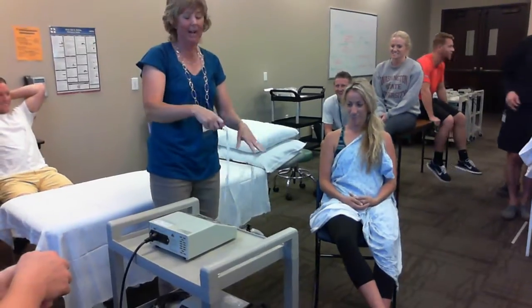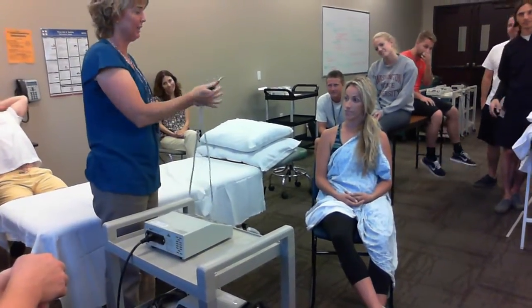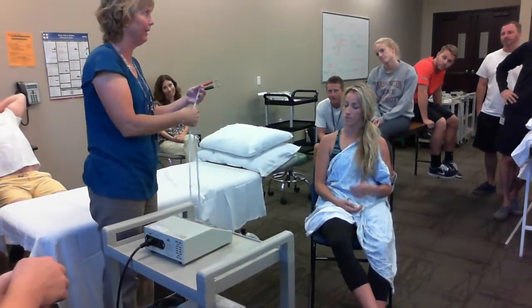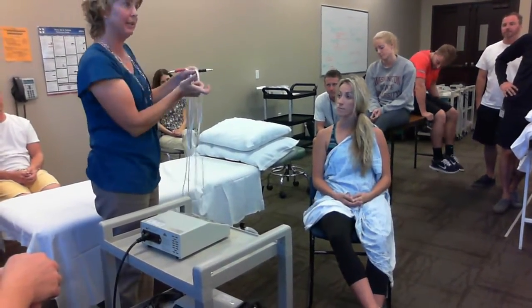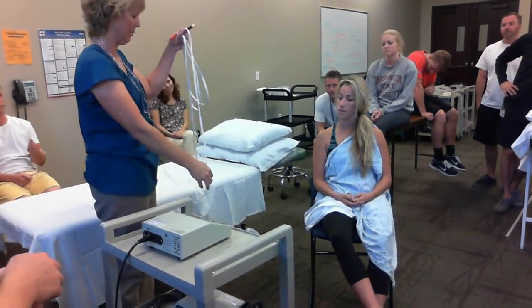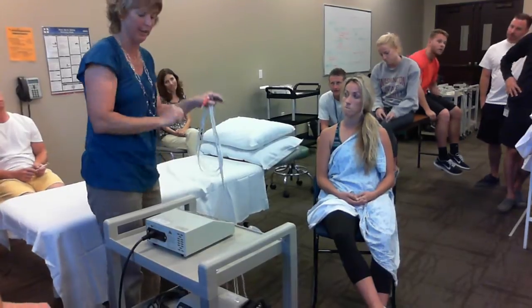Okay. So I don't have to have black and red. In fact, some clinics they're not even black and red. They could be blue and purple. But by having that, it's going to help you see where I'm putting the electrodes on her. Because the important thing is that I take 2 channels and I do a crisscross for interferential current.